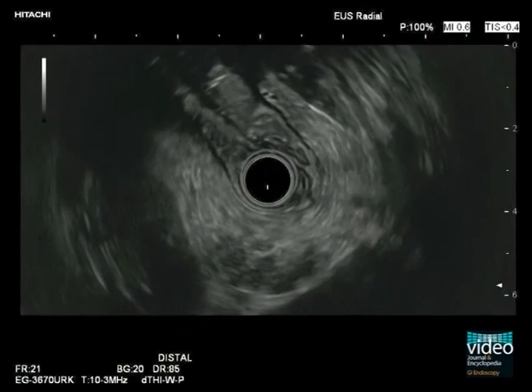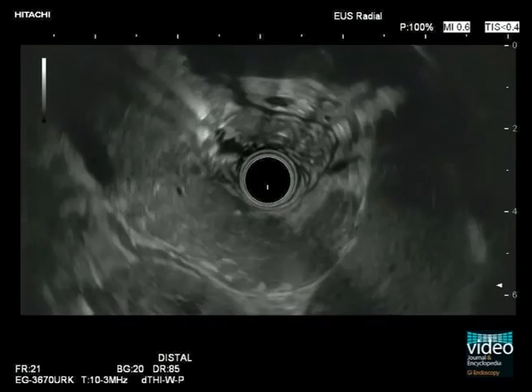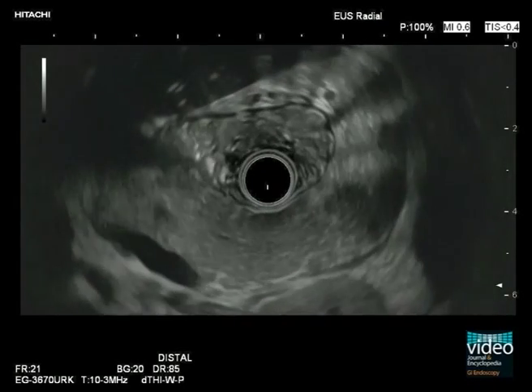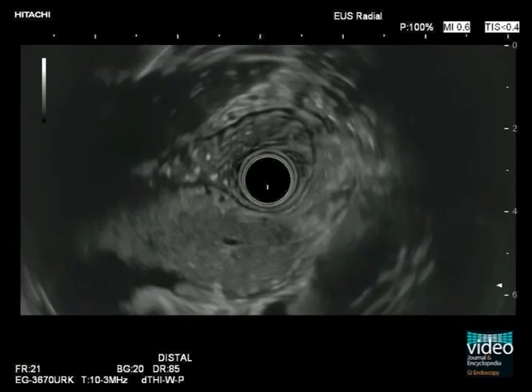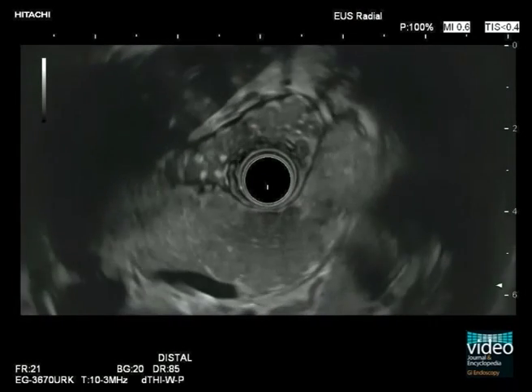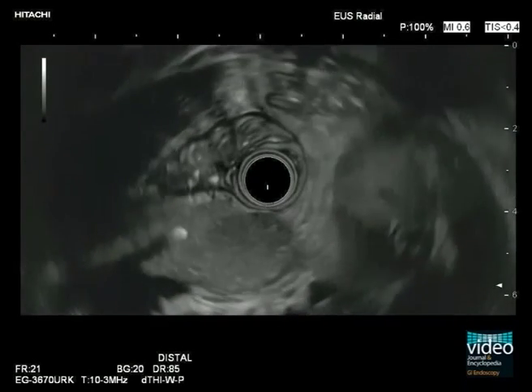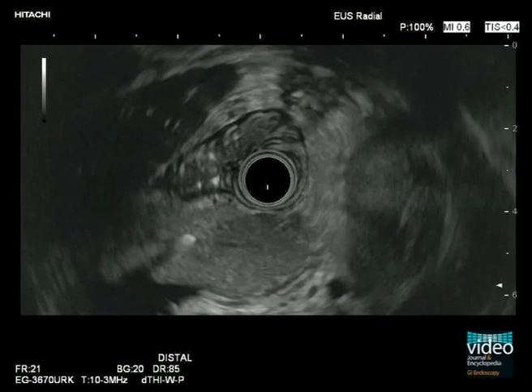This is a very similar case of idiopathic pancreaticolithiasis causing recurrent acute pancreatitis. The 32-year-old female patient credibly denied moderate or heavy alcohol intake, and detailed history and results of laboratory testing did not reveal any of the established causes of pancreatitis. Radial endosonography shows a somewhat inhomogeneous pancreatic tail and body with a hypoechoic rim. The pancreatic duct is slightly dilated, and surprisingly a solitary small pancreatic duct stone is observed.